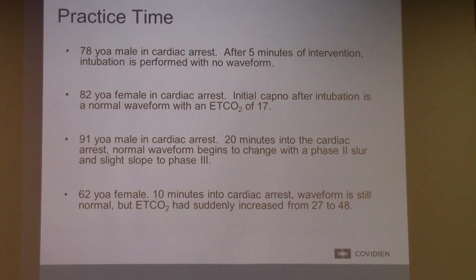What are the three things we discussed that could do this? Ross? Bicarb, and then I mentioned briefly the annoying one. Epi may or may not. Okay, so using what we know about ROSC and its effect on end-tidal CO2, how can we discern whether it's ROSC or something else? It stays when you stop CPR, versus drops like a rock. Good, you guys got this.